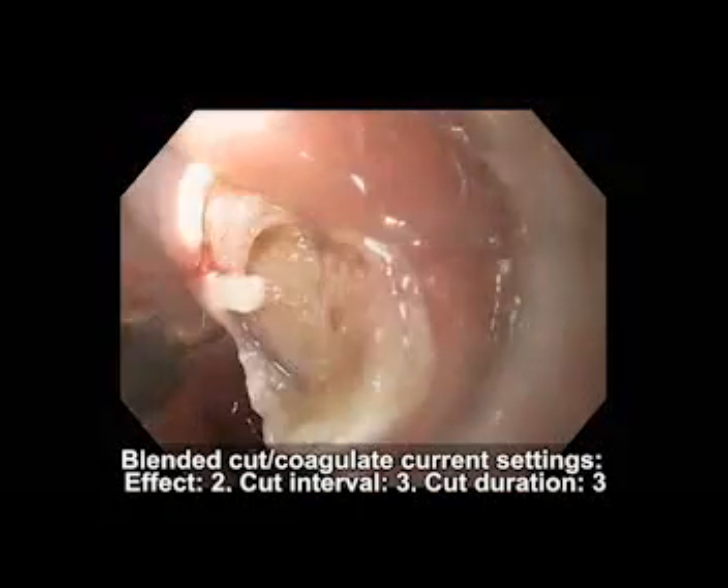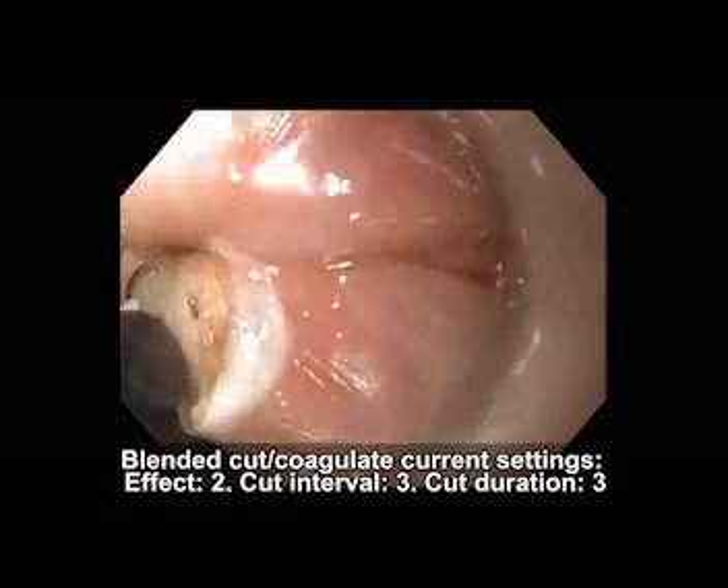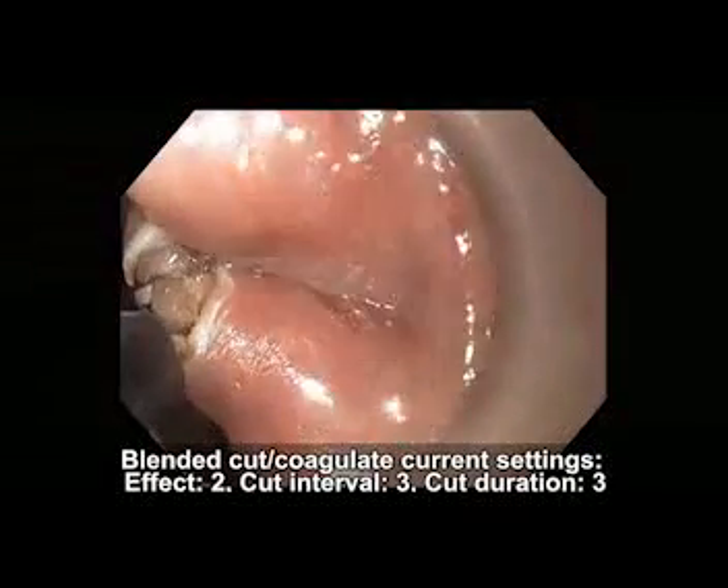An automated blended cut and coagulation current, or pure coagulation current, is most often used, similar to that used during ERCP.